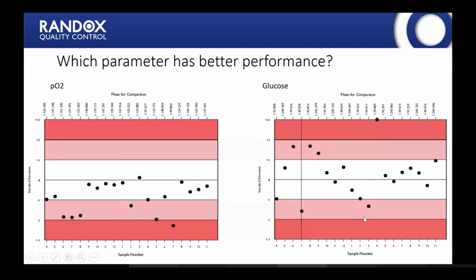For glucose, we have a wider spread of results. We have one outlier result, but in this instance, the lab has performance both above and below the mean for comparison. And this would be a more normal and preferred performance. We don't want to see this. This indicates the negative bias, and we don't want our performance to be running with positive or negative biases. We would want to see this spread of results on either side of the mean for comparison. So that's how this performance looks on the Levey-Jennings charts.